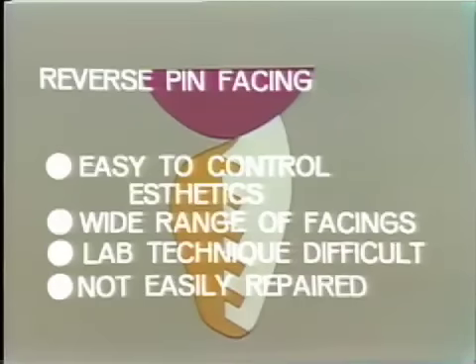The lab technique is a little difficult for any technician who is not accustomed to the procedure, but once it's been mastered and dealt with, it is not particularly laborious to do. By and large, this type of Pontic is not easily repaired. One has to bear in mind, however, that a correctly designed reverse pin facing will very rarely ever fracture.